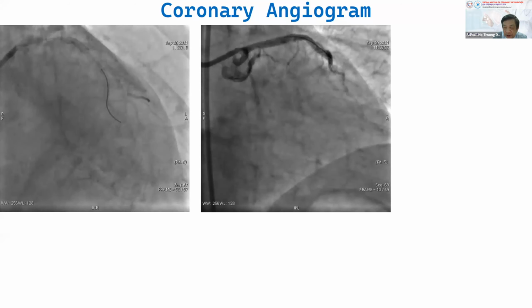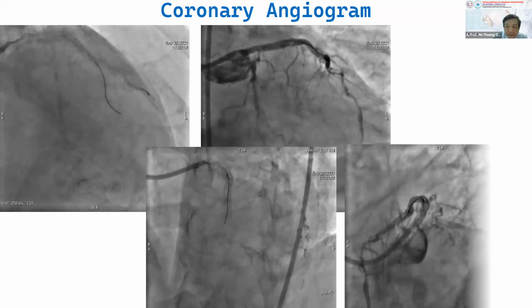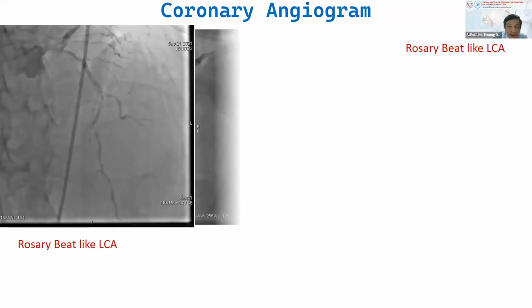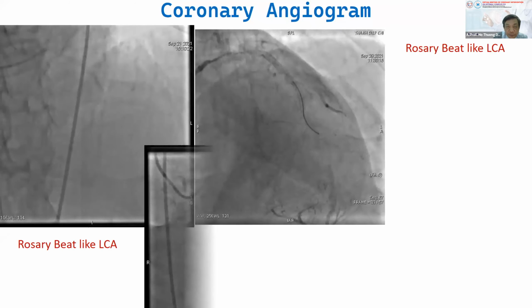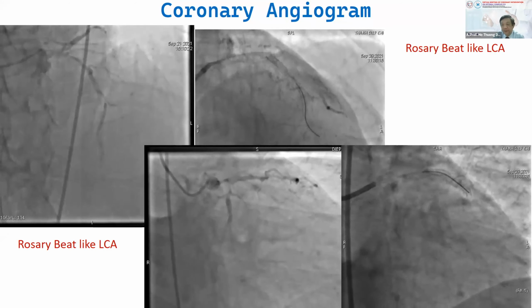I don't touch the circumflex. It's very complicated. So before PCI, after PCI, before PCI, after PCI, I think the result is good.